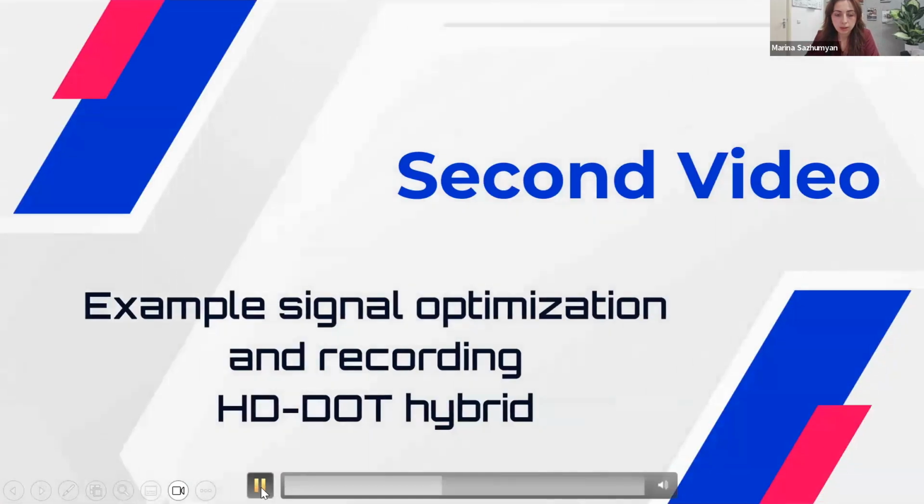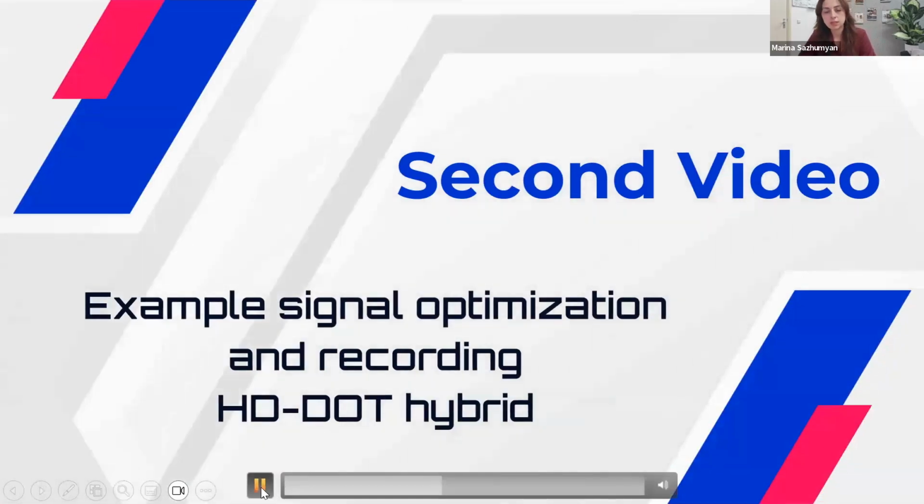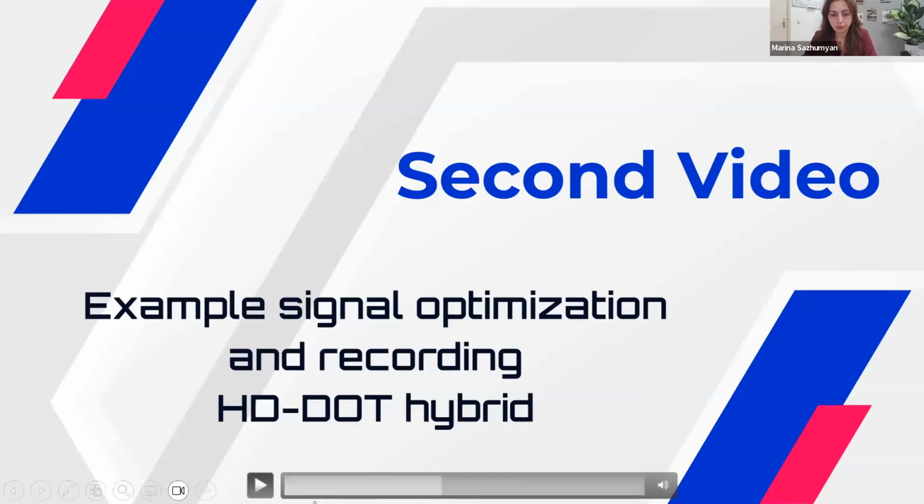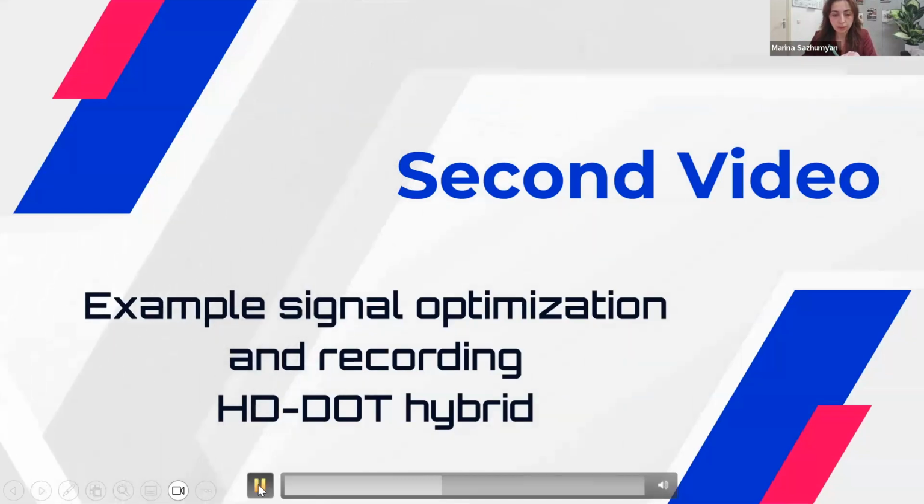Yes. So this was the first example of a standard whole head imaging. And now the second example we have prepared is actually using a hybrid high density and a standard motor montage, which you will see in a minute. And here we are going to demonstrate how to enable the MLI and the EFE features. And we will look at the overall signal quality together.